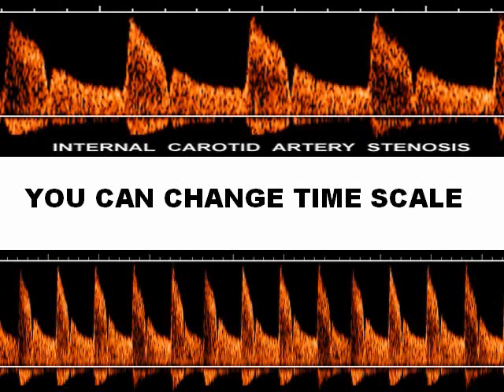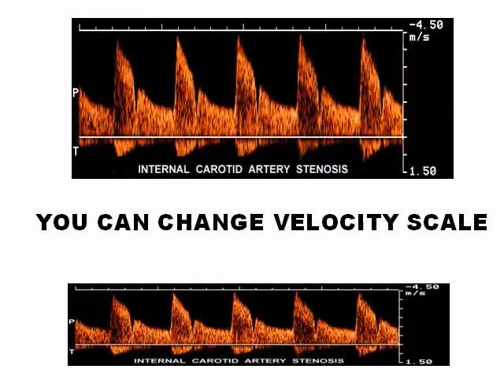You can change the time. That does not mean that you change the velocity. That means that you present the information at different speeds. In general we always use the same. Only sometimes we change it when we want to get more details, but it's very rare.